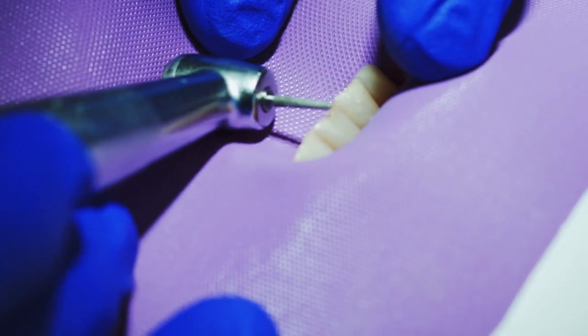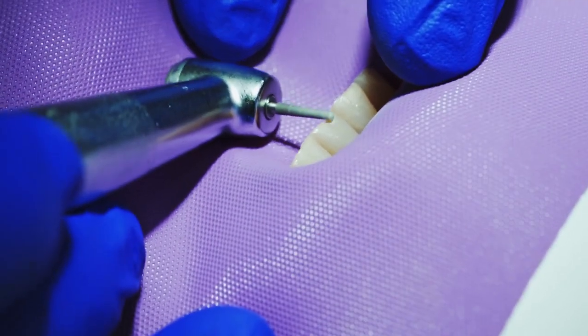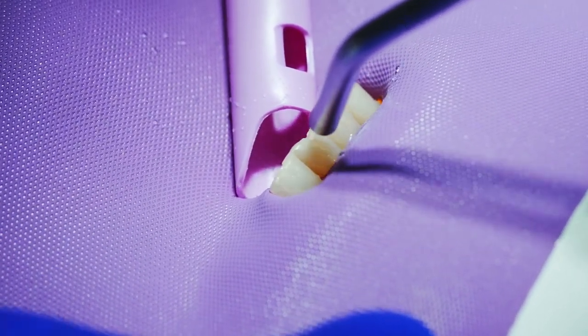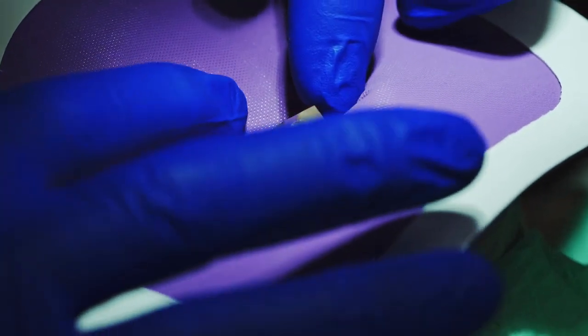We will clean the space. We'll rinse it. Then we'll use a clear matrix to isolate the area. With it isolated, we will now proceed.